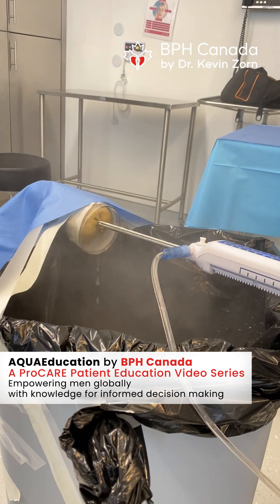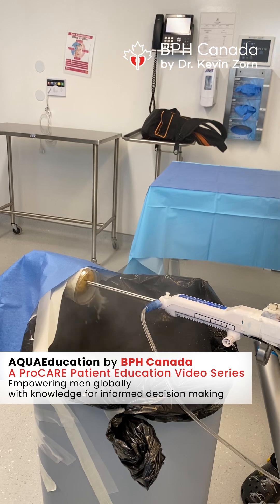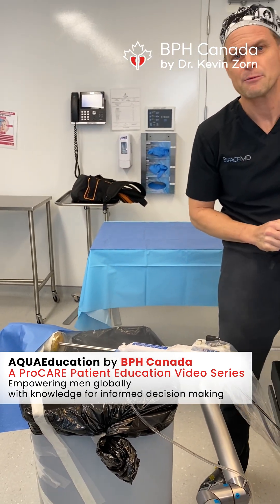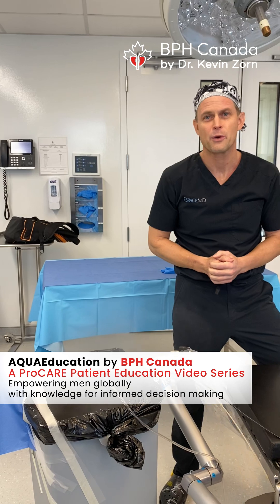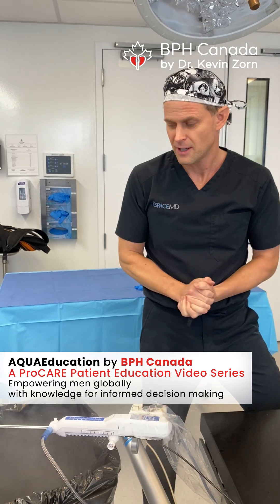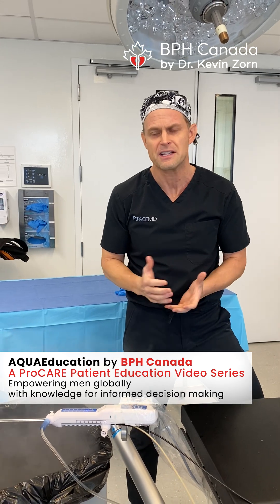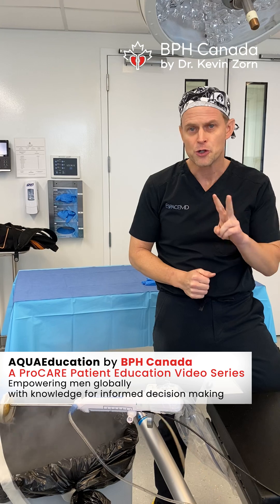The length of treatment is up to 7 centimeters. We should see exactly what we've mapped. For the patient, we can be gentle after this and avoid all factors that can cause incontinence, really getting a much smoother opening quickly, getting the patient off the table, and allowing for much quicker healing because we're not burning the whole area with heat. This is a heat-free treatment. We're doing this in less than 5 minutes. In general, we do two passes to really get the best, most durable outcome.